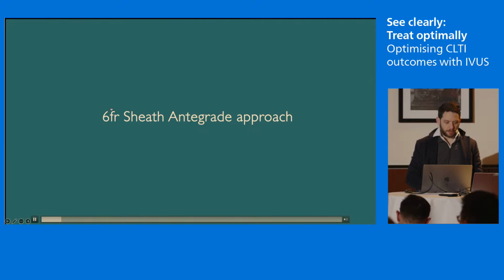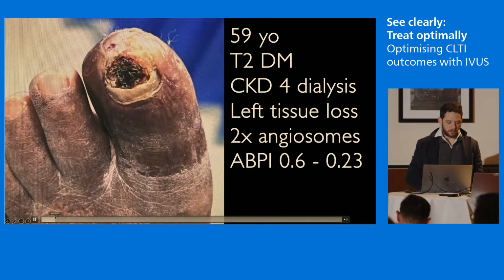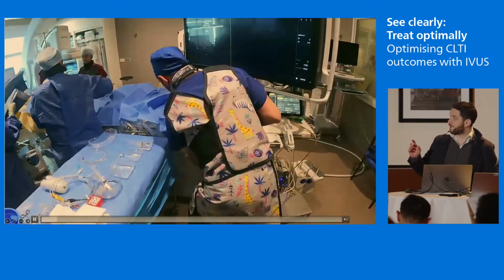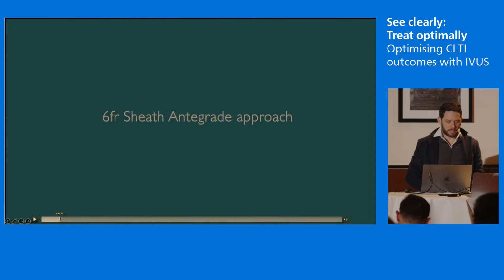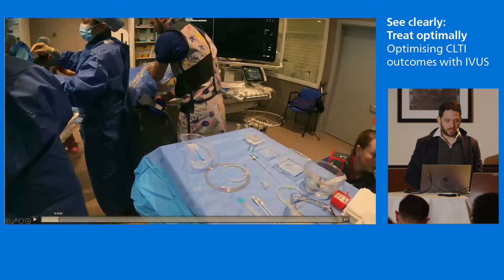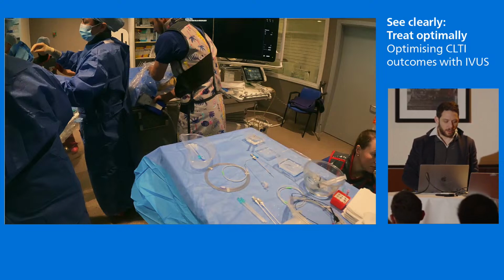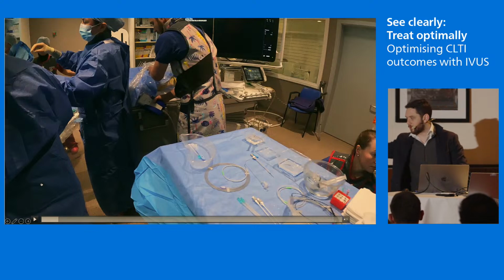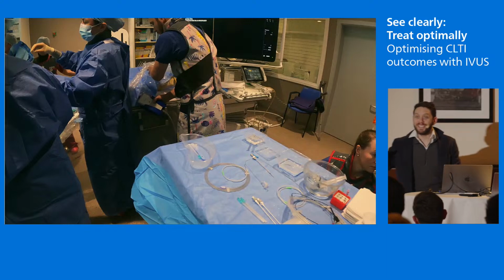That first little bit there is me setting up the room, to show how important it is, if you're going to be considering using IVUS in a case, that you have the PIM connector, the box I'm holding in my right hand, close to where your sheath is going to be. It's such a basic step to fail at the very beginning, because when you've got the drapes and the pedal and maybe your diathermy if you're doing a hybrid case, there's so much in the room. You need to have real estate.